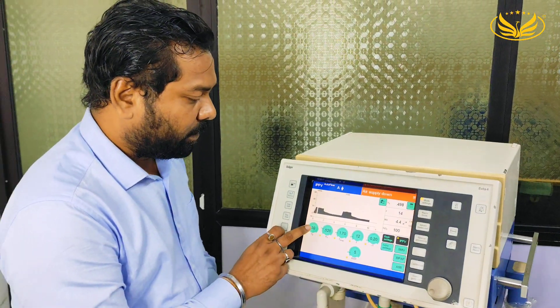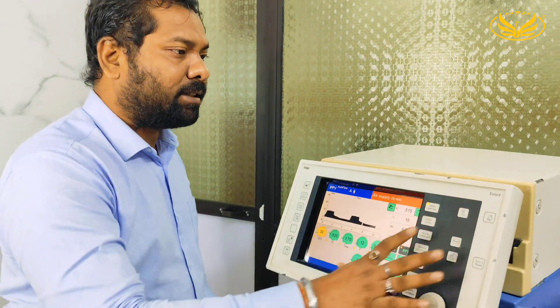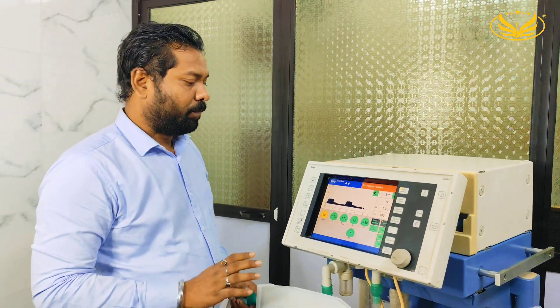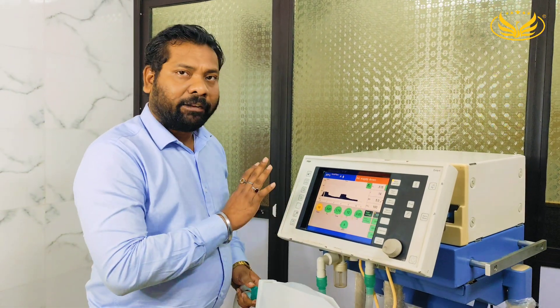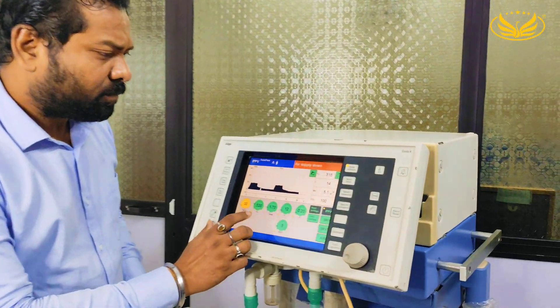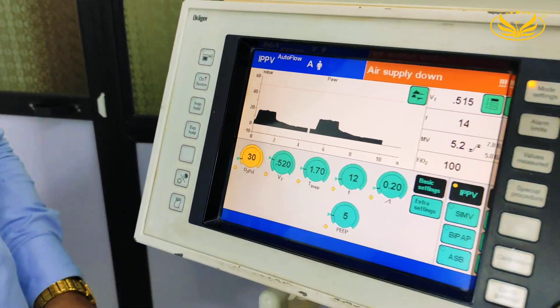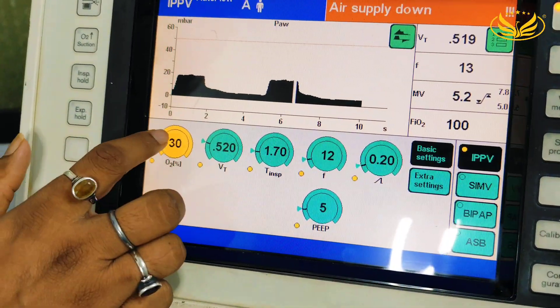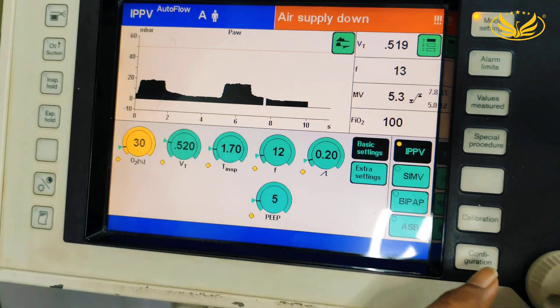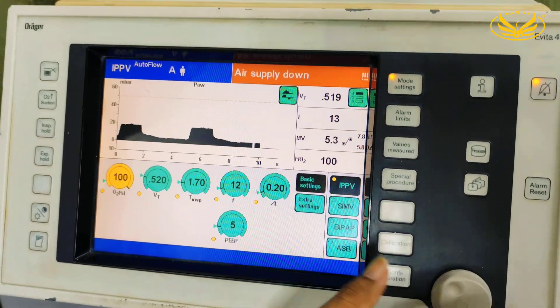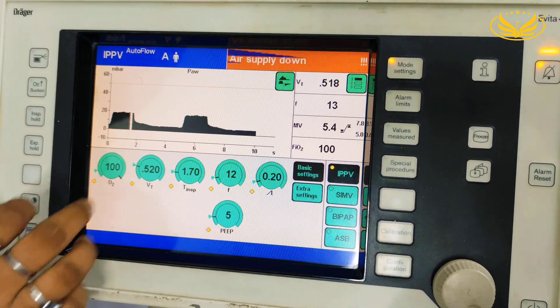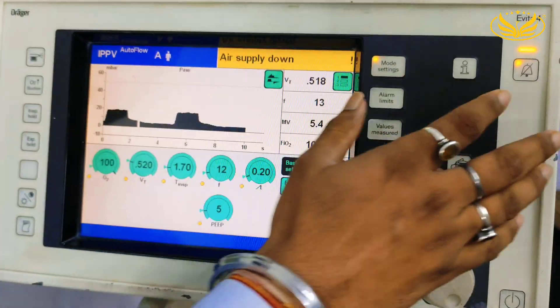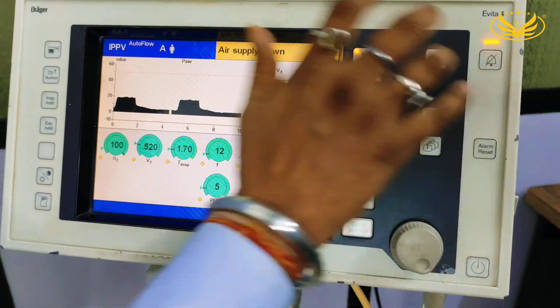Now from here we have to change the parameters. This ventilator is exactly similar to the Evita XL. The only difference is that the display size is small compared to the Evita XL — rest everything is similar. Now you can see we have kept the alarm on silent, as we have not attached the air compressor.